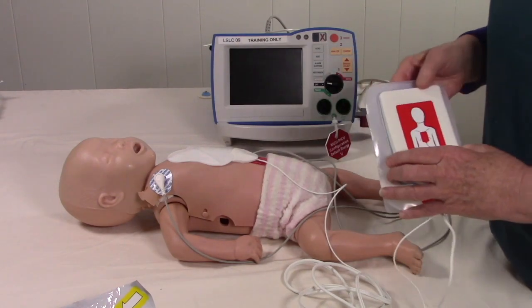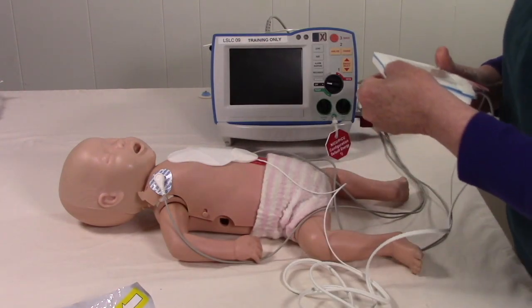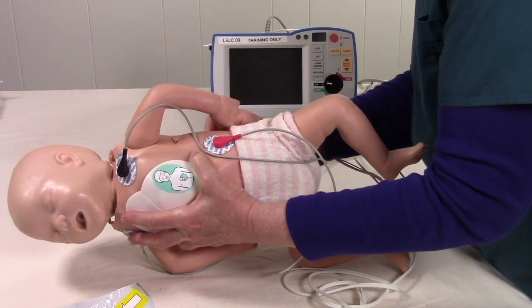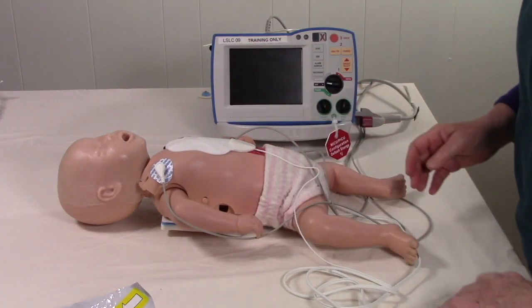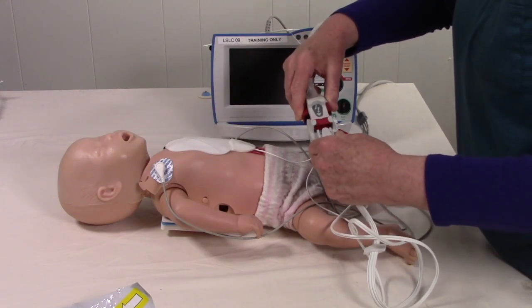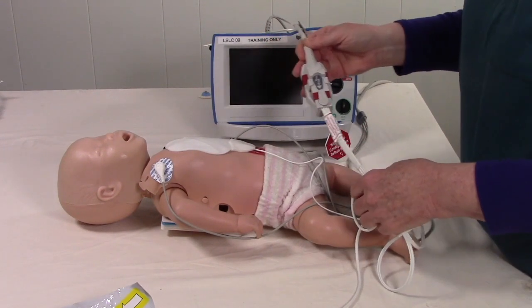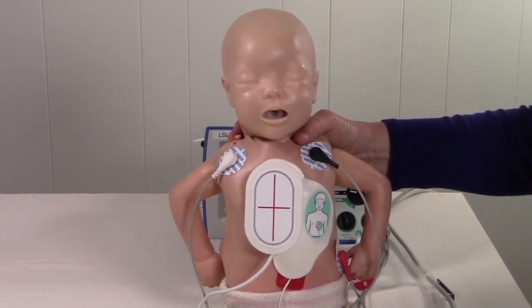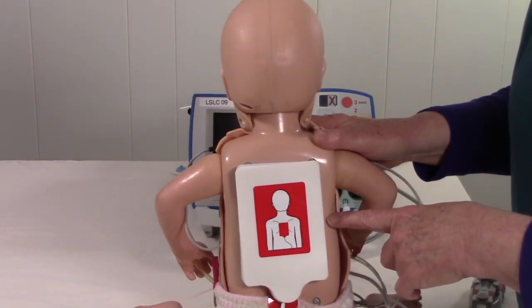Now let's place the posterior pad. The picture shows you exactly where it goes. Roll your infant, place it on the back, and then place your therapy pads into the therapy cable. This is the anterior view of the One Step Pediatric CPR pads used with the Zoll R-Series, and this is the posterior placement.